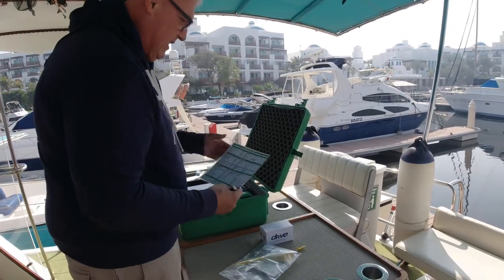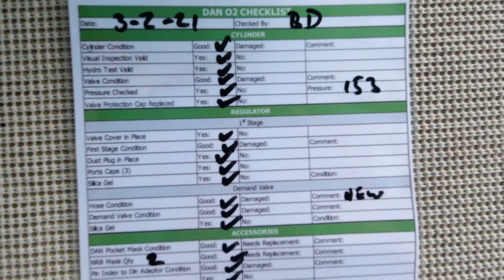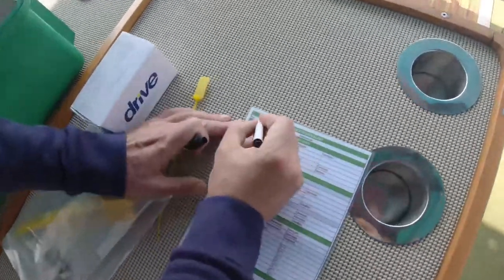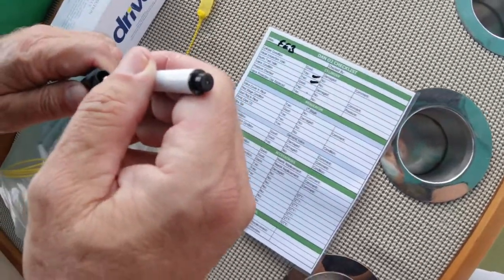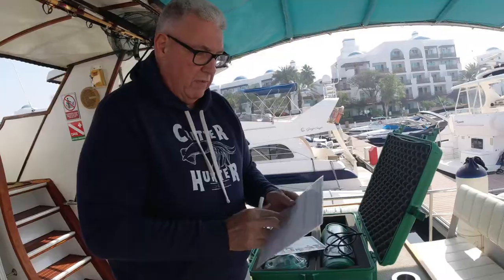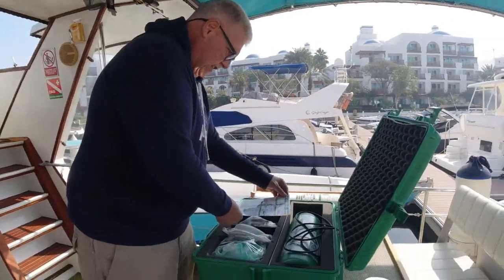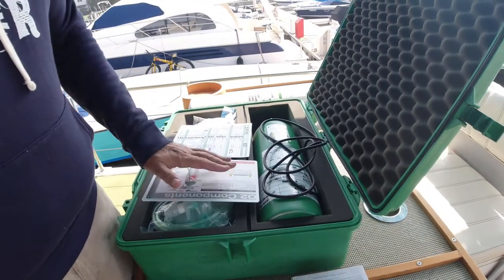I'm going to fill in the checklist when we've finished. Every month we record the date and checker's initials. I use an erasable pen so we can write the month, tick it off, and next month just wipe and reuse it. We've plastic-laminated the checklist which makes it really easy to use. It goes in on top so when someone opens the box they know it's been checked and haven't got to worry. The O2 slate is right there too.